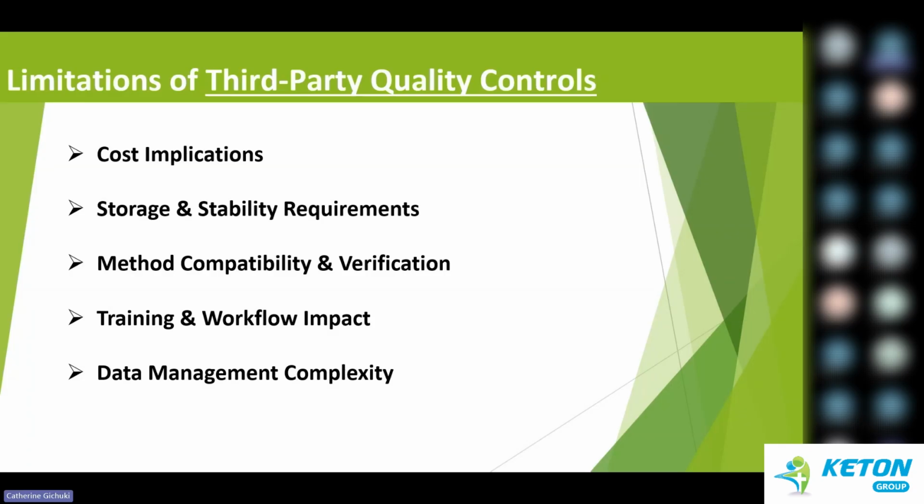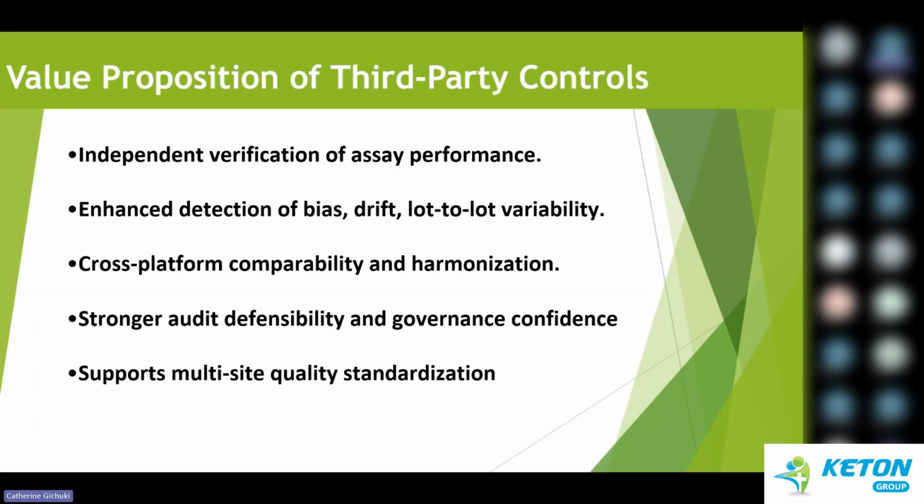additional QC data to review, and to review the trends. Of course, you'll have more. If you're doing the two of them together, you will have more to review. And then it also requires a very good way of analysis. For example, nowadays there are LISs and software that are supporting this kind of interpretation.